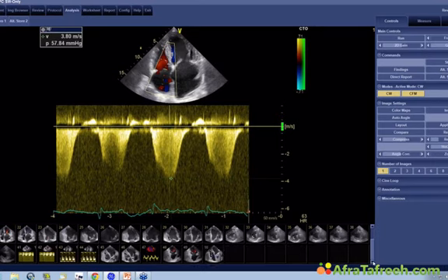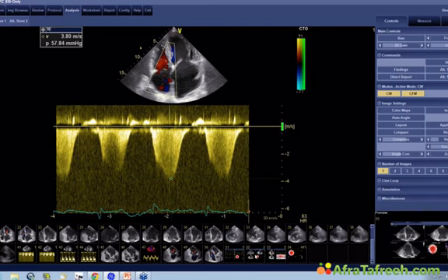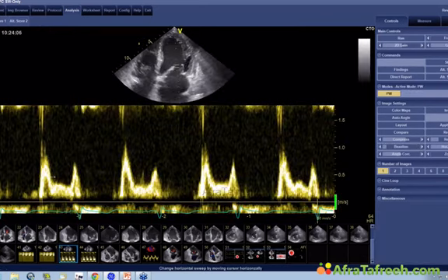Okay, I guess I have to speed up a bit because I'm running late, but I do want to show you one very important last image again. Well, let me show you 2 images because you should see this as well. Then I look at diastolic function. You can see that she has an E wave which is higher than the A wave, and she has a small little L wave.